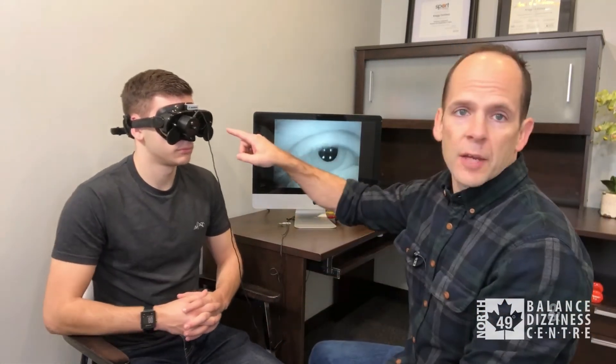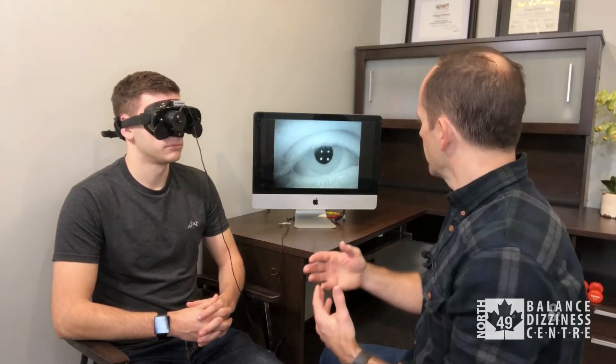Now we're going to move from doing tests in room light to having Zach in the dark. As mentioned, if it's from the inner ear we may miss some nystagmus in room light, so the goggles ensure we're not missing it. The goggles also make the eye appear larger, making it easier to see. We'll check spontaneous and gaze-evoked nystagmus with visual fixation removed.